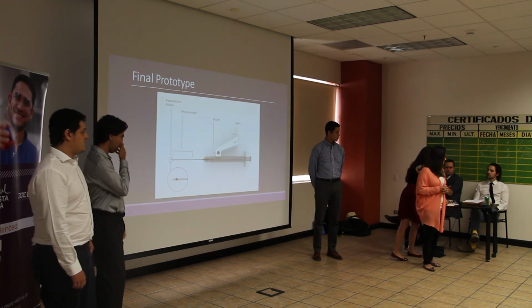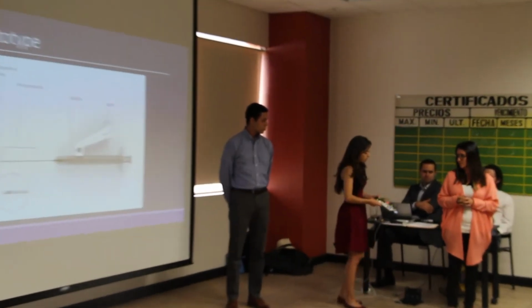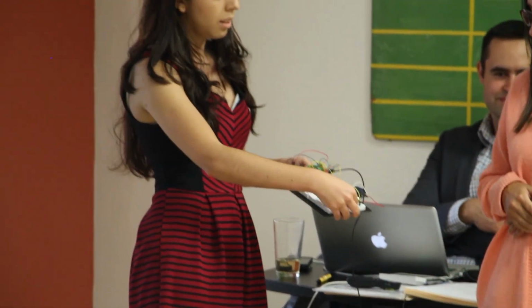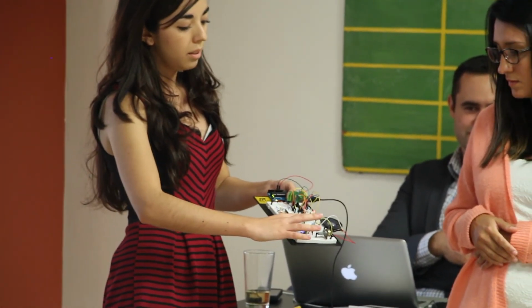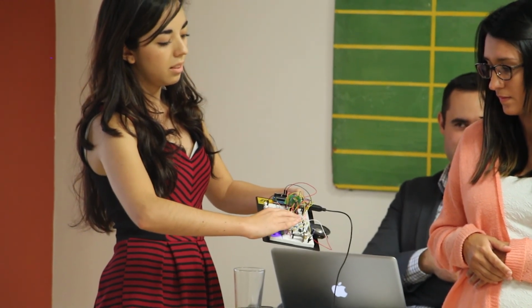Right here, we have a prototype of the alarm system. So this is the sound the doctor is going to hear when the needle is outside the body. And as it goes deeper and it goes darker, it goes slower, so he knows he needs to stop.